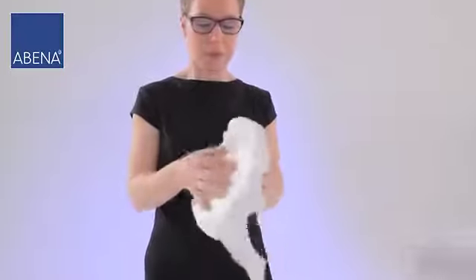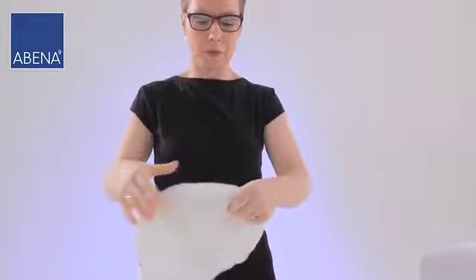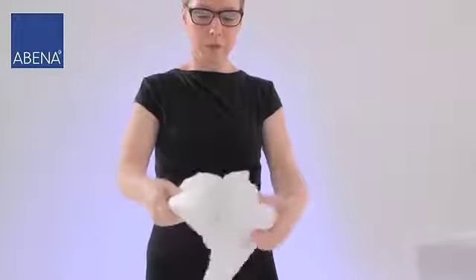Fold the product lengthways with the back sheet turned outwards. Please do not touch the inside of the brief.